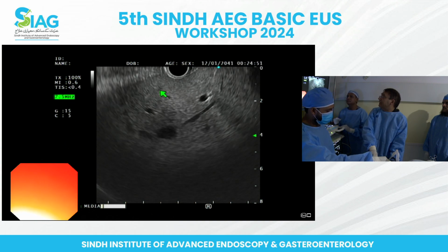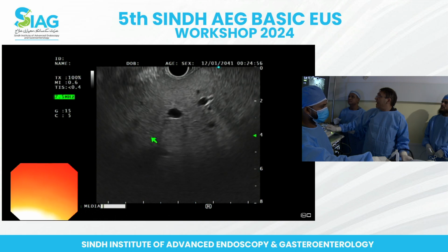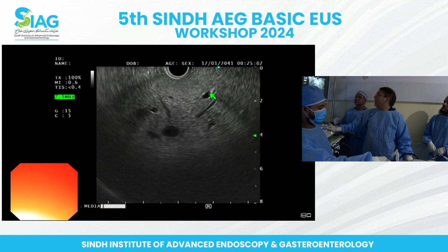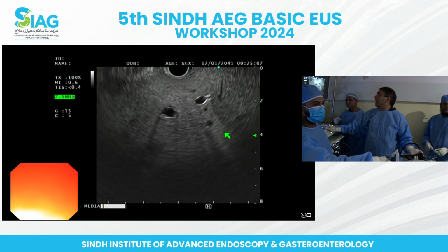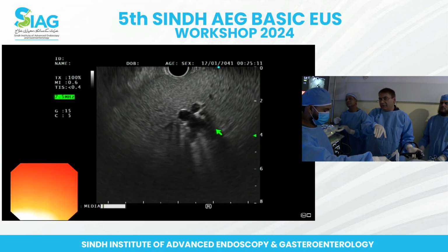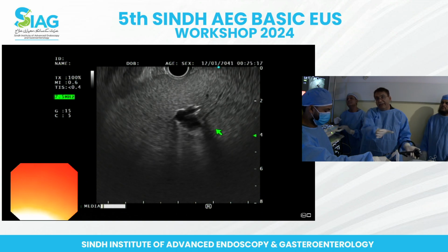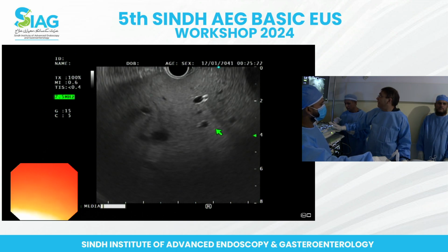Wow. So all the segment above that branch, where the arrow is, is segment 5, below that is segment 8. In this case, if I go to the right, the segment above this branch is segment 6, and below that is segment 7. If you are in the second part of the duodenum, you see the right kidney. The segment which touches the right kidney is segment 6 anyway, but that is from the other side you are looking at. Okay?